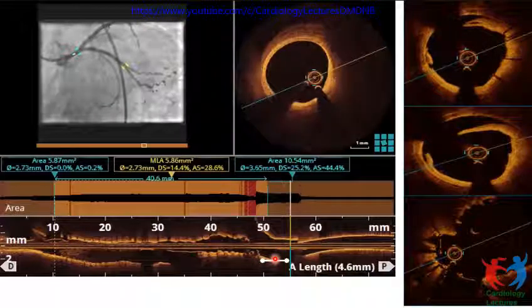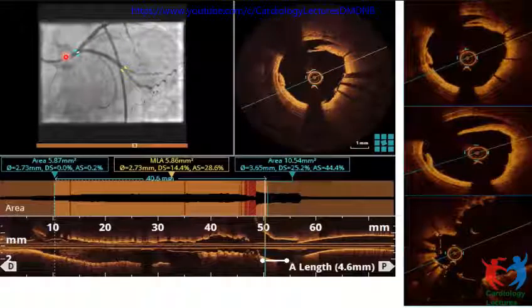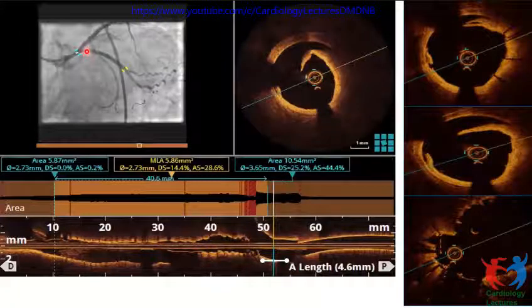But now, since we have stented the LAD and the LCX, the patient is stable. Sometimes we have just left this also because proximal dissection generally does not extend beyond the stent. It can be put for medical management. But in a left main, such a big dissection is controversial. It's always ideal to stent it and treat it if feasible.